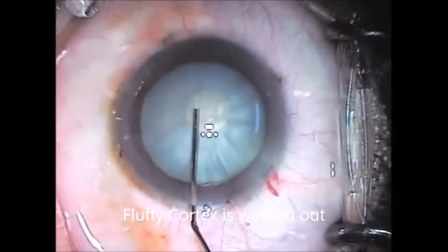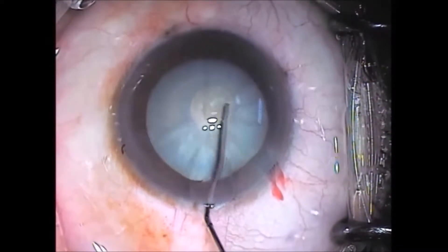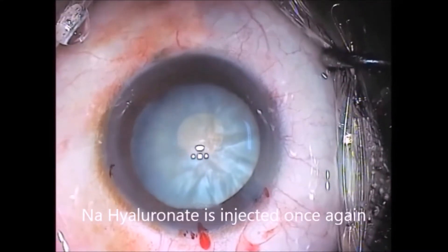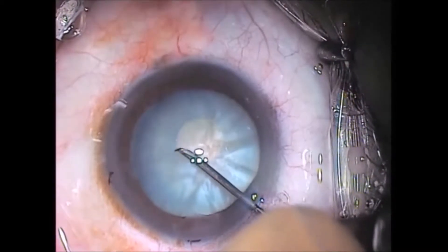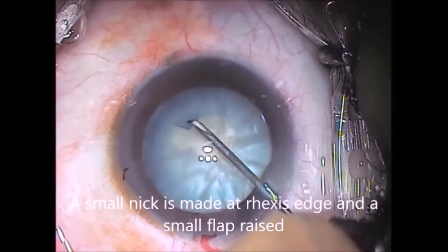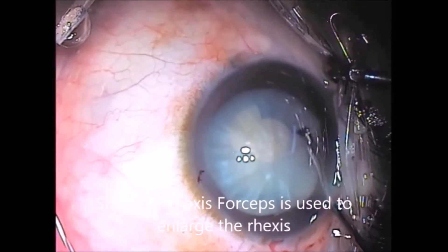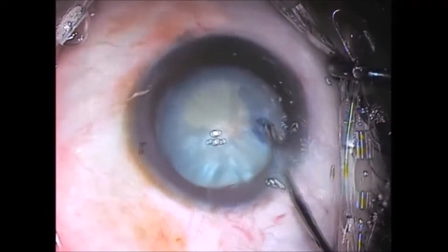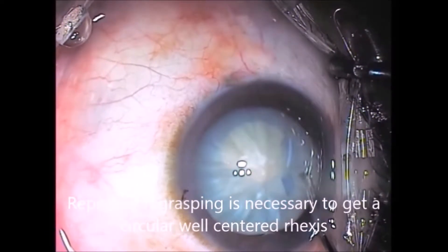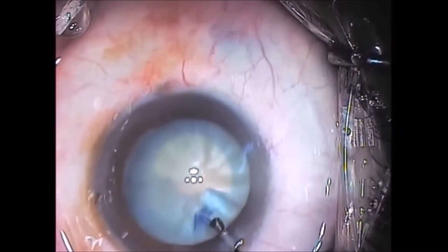Fluffy cortex is washed out to relieve possible intralenticular pressure, so that the rhexis will not run to the periphery when it is being enlarged. A small nick is made with a 26 gauge needle and a capsule flap is raised. This flap is grasped with a side port rhexis forceps and the rhexis is enlarged. Repeated re-grasping is necessary to achieve a good rhexis.